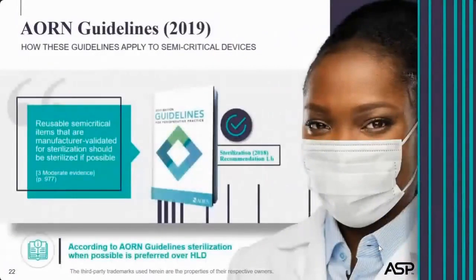Professional organizations, for example, AORN, sit on task forces and committees for various organizations and agencies, but also provide individual guidelines for clinical practice. As it relates to semi-critical devices, AORN has a guideline stating, reusable semi-critical items that are manufacturer validated for sterilization should be sterilized if possible. Because AORN uses scientific research to base the guidelines, this particular one has been identified as moderate evidence to support it.